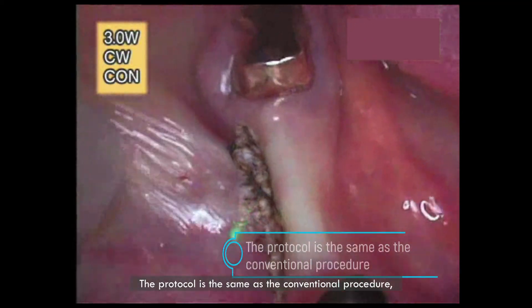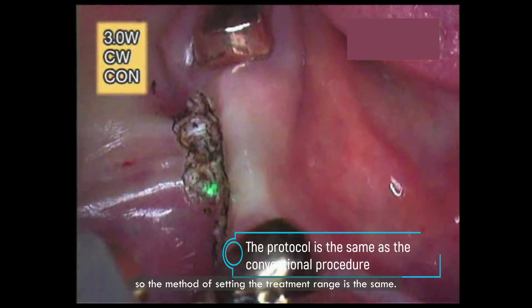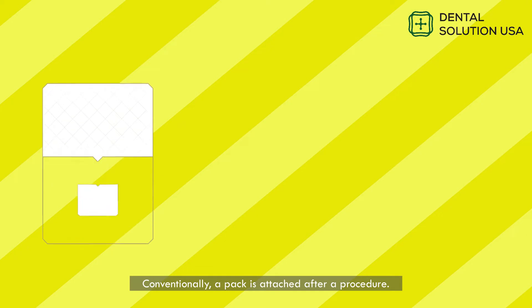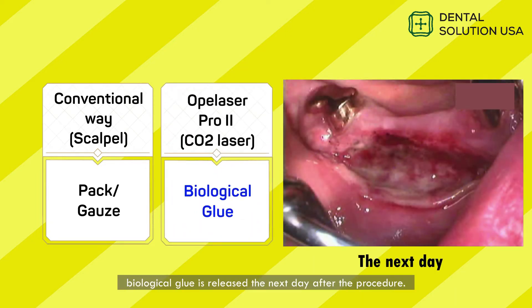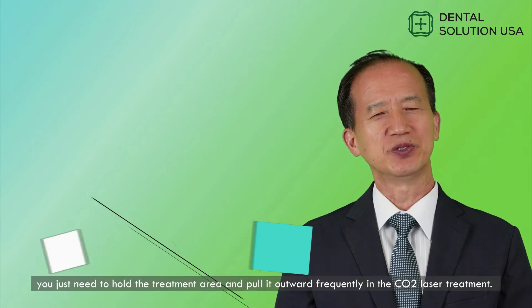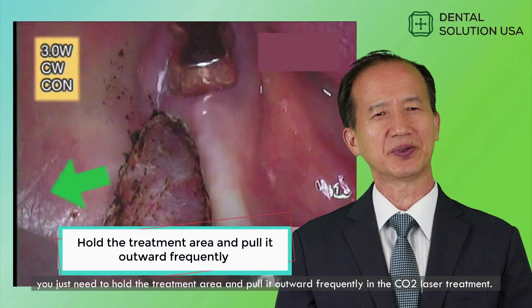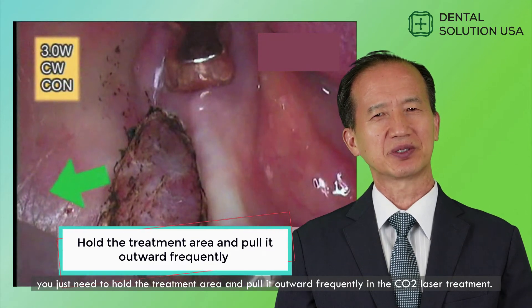The protocol is the same as the conventional procedure, so the method of setting the treatment range is the same. Conventionally, a pack is attached after the procedure. After the procedure with Opulaser Pro 2, biological glue is released the next day. Instead of attaching a pack, you just need to hold the treatment area and pull it outward frequently in the CO2 laser treatment.